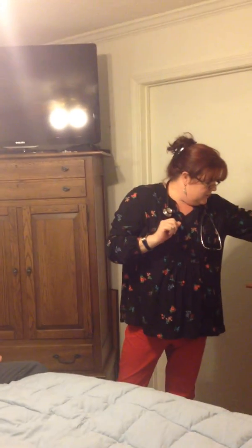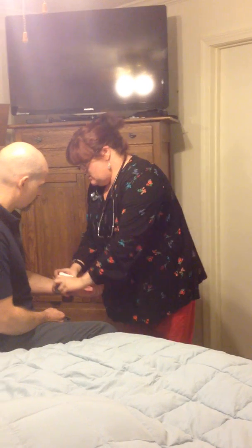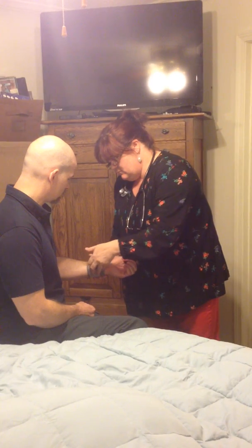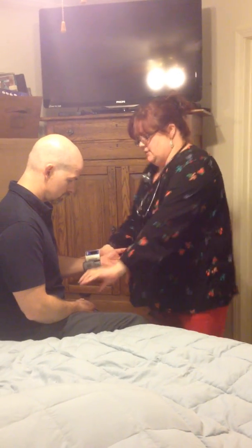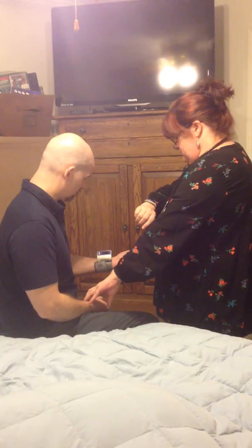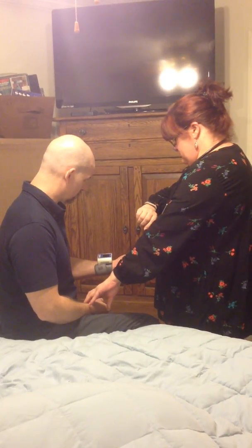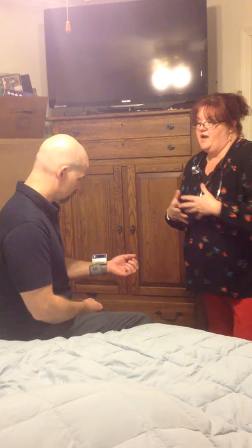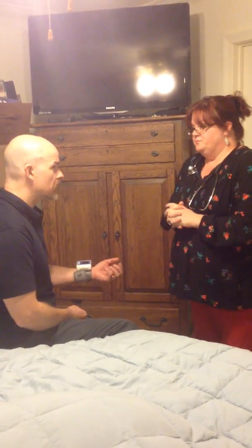So what we're going to do first is we're going to go kind of head to toe. Okay? So first what I want to do is I want to go ahead and check your vital signs real quick. And if you'll just sit there with that, just about like that. Okay, so your pulse rate's about 80. Is that about normal for you? I think so. Okay.